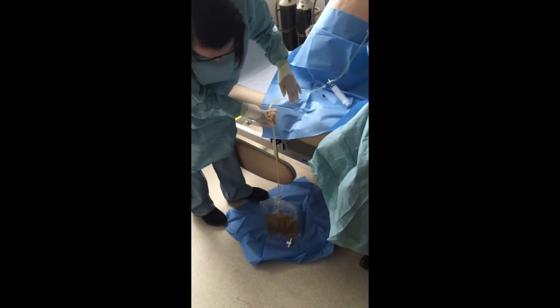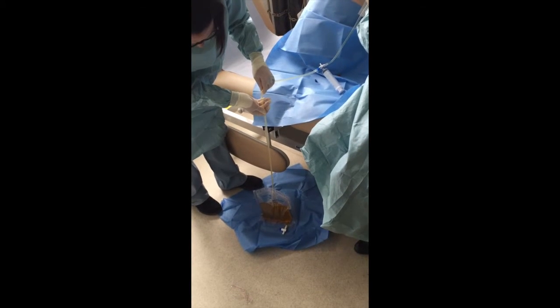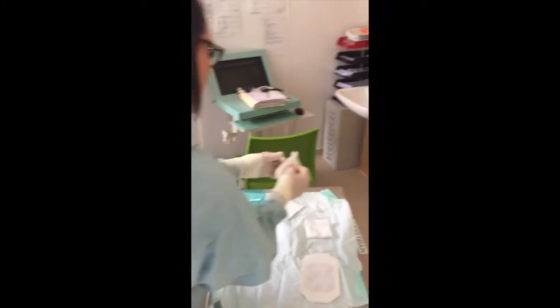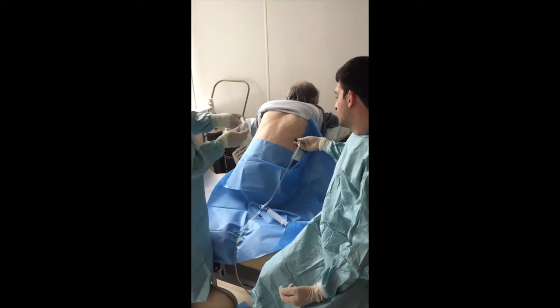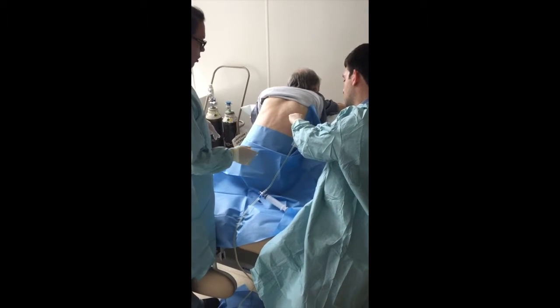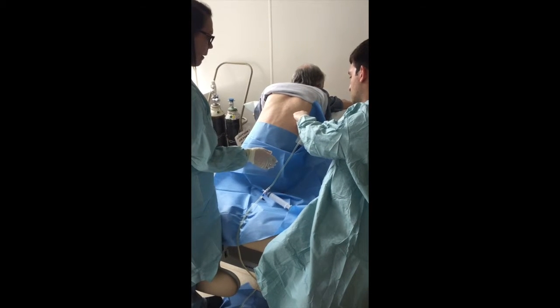Okay. So I think we're nearly done. But obviously, this is a therapeutic, because he's got a large volume, we're going to do a diagnostic and therapeutic. So there's 1 litre of fluid in that bag now. Yeah. So what we're going to do is we're just going to get some folded gauze here. You don't have to do Valsalva manoeuvre because it's only such a small bore tube that you've got your cannula in. Yeah. So it's literally just popping your folded gauze over the top of it, taking your tube out and putting your gauze straight over the top of that.